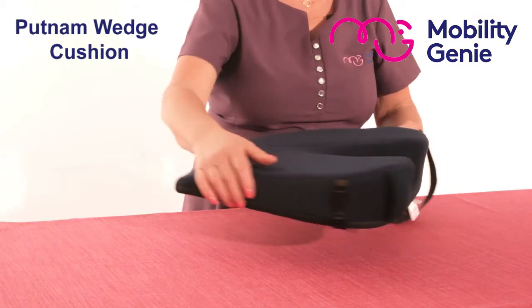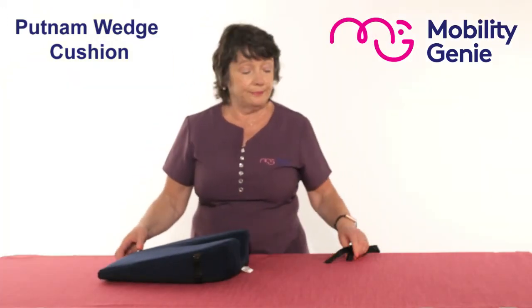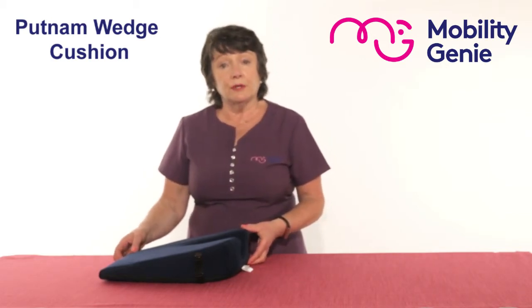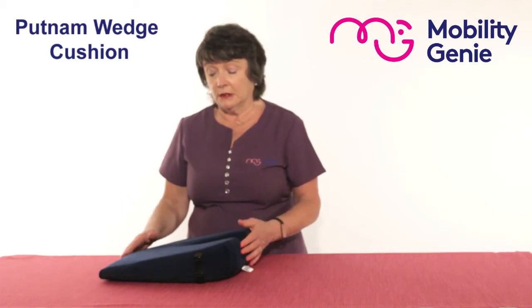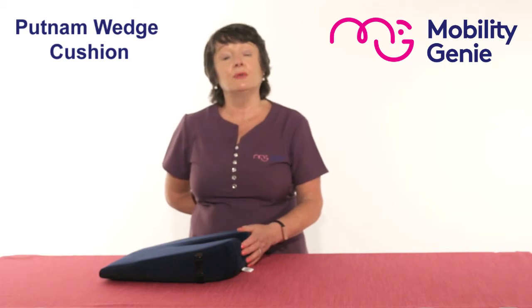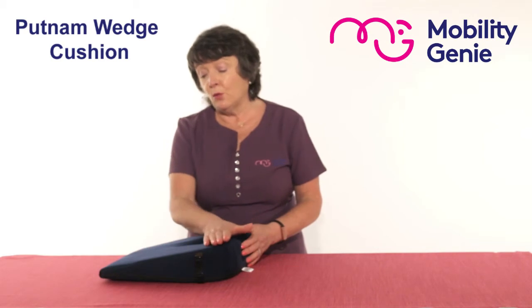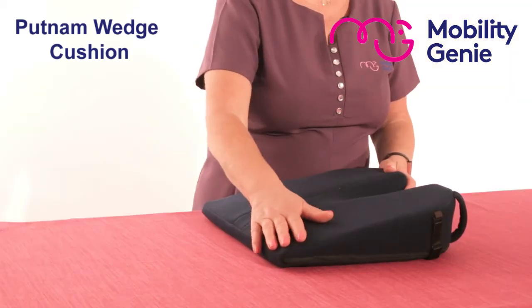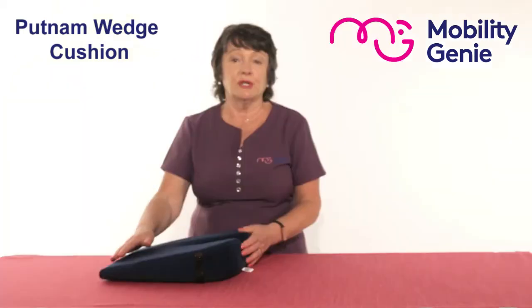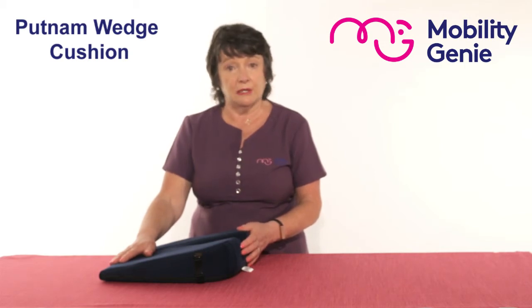The other way you can use a wedge cushion is if you're working in an office chair and leaning forward over a computer. If you have a good supporting chair with a good lumbar roll behind you and you're leaning forward, you're not getting the benefit of the cushion behind you. Whereas with the wedge cushion under you, it tilts your pelvis forward and puts your spine into an S shape, which is the correct posture when sitting and gives relief to the lower back.